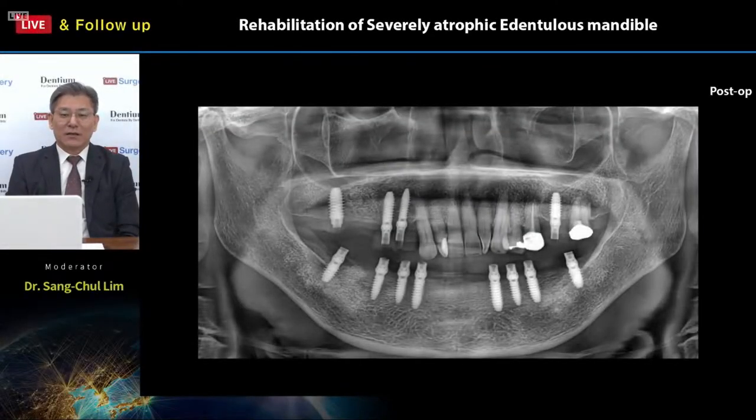Welcome back. Actually, I'm going to share the final result of today's surgery. This is a panoramic view of the whole implant fixture installation, tissue level, on the lower mandible and upper jaw. As you can see, all the fixtures are very nicely done, parallel, with good fixture insertion depths. So all of these fixtures should work very well in the future. This case goes to temporization with PMMA temporary within maybe 1 or 2 weeks.